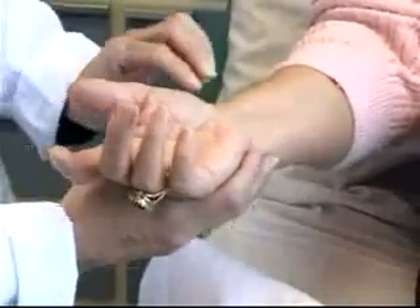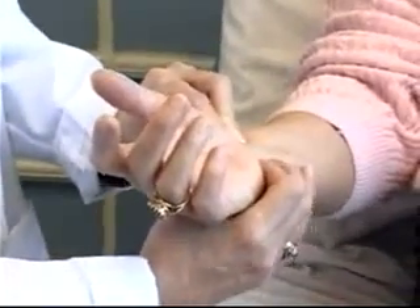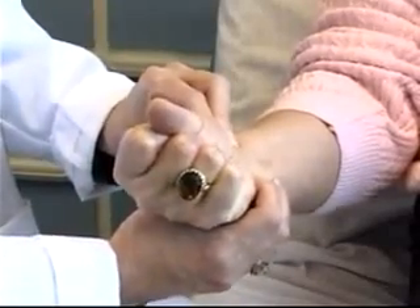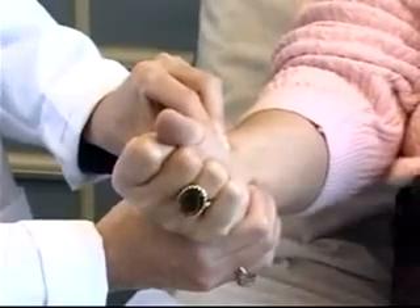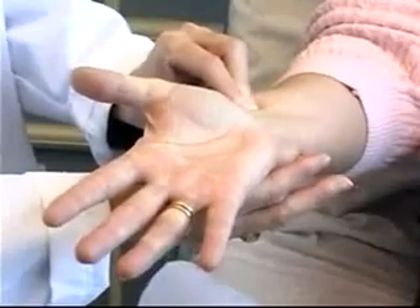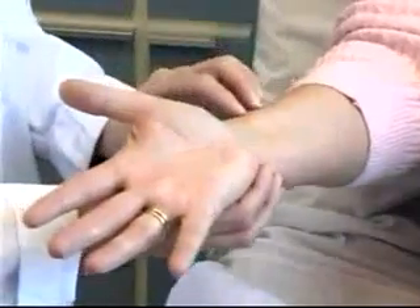The Allen's test is performed as follows. First, palpate the radial artery with your fingers, then palpate the ulnar artery. If you can't feel the ulnar artery, palpate the area closest to where you think it would be located. Ask the patient to make a fist as tight as she can and maintain that for approximately 10 seconds, while you occlude both the radial and ulnar arteries. After enough time has elapsed, ask the patient to release her fist and release your grasp on the ulnar artery. Watch for good flow returning to that hand. The hand pinks up nicely — this is a positive Allen's test, and you are okay to proceed.